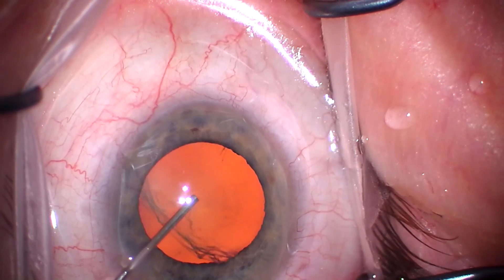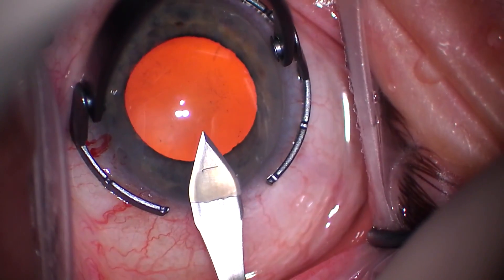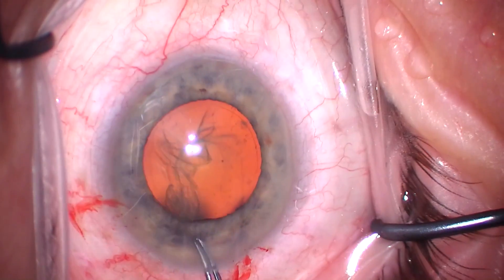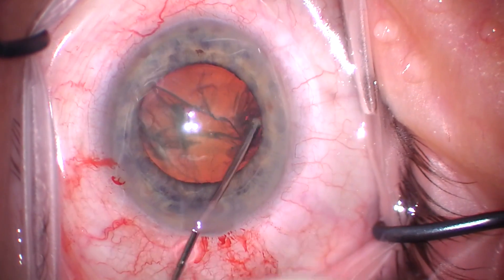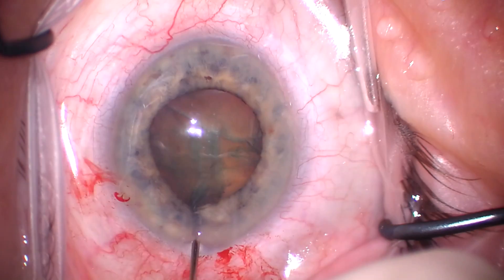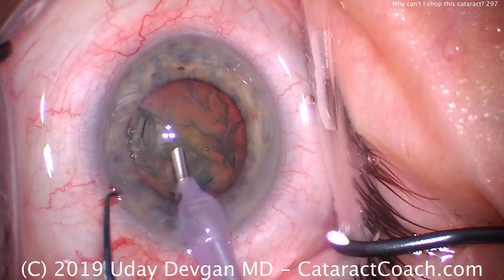The beginning part of the case is all routine. Here's some viscoelastic, making the main faco incision, everything totally normal. We'll finish up the capsulorhexis and now some hydrodissection. Everything again seems pretty routine. Patient does take Flomax, a little bit of a smaller pupil, but not too bad.